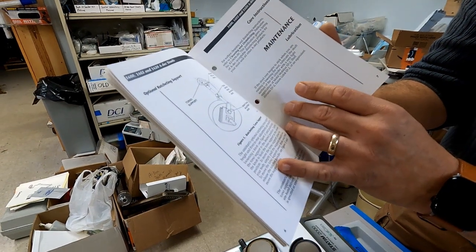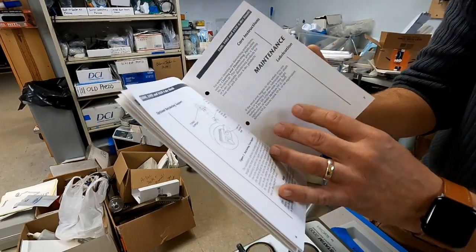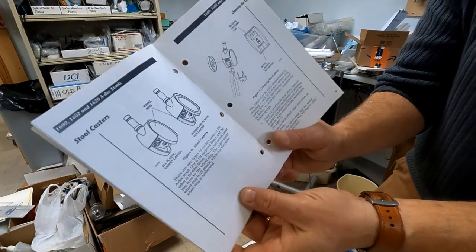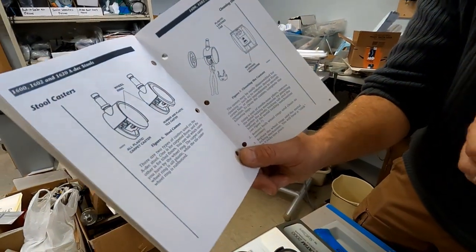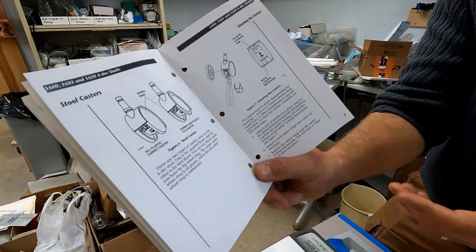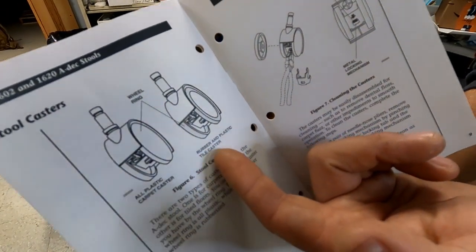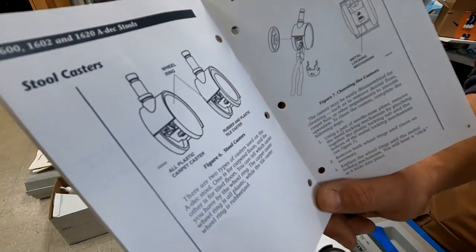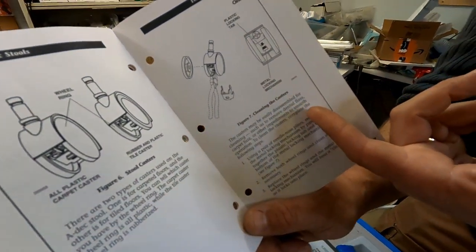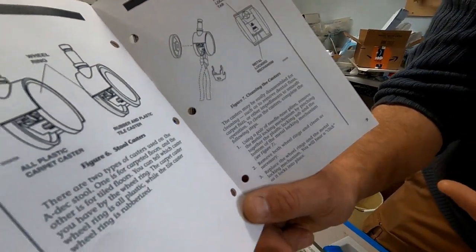But now we come back here to this little section that I like to call maintenance. Now this is, okay, lubrication. All right, great. How to lubricate your stool. But then we get to this place, and I've been doing dental repair for 20 years, and I've been doing my own business for 5, and I've never known this. On the bottom of these ADEC casters, you can actually remove the individual wheels to get out hair and dental floss. And I didn't know that. And so I was just like, wow, cleaning the casters. This is my job, and I didn't even know until I opened the book.